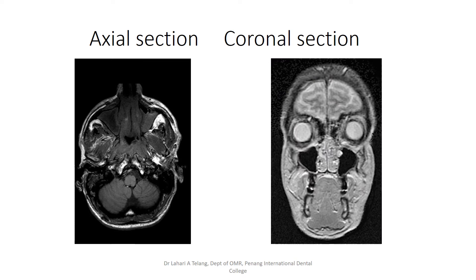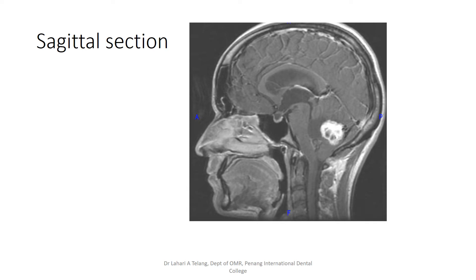When you look at the scans, the sections look very similar to a CT scan for someone who is a novice, but when you look at them more clearly, you will understand that there are differences. This is an axial MRI, this is a coronal section, and this is a sagittal section. The key difference is that there is much better soft tissue visualization in an MRI scan.